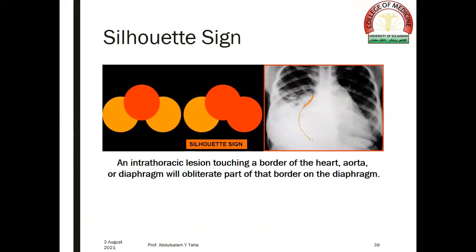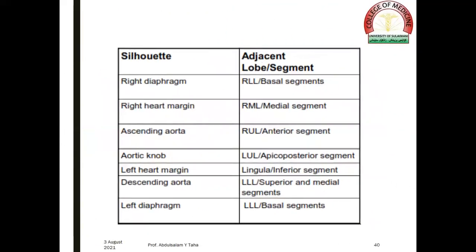The silhouette sign is an important radiographic sign. When an intrathoracic lesion touches a border of the heart or the diaphragm, it will obliterate part of that border. In this chest radiograph, the right cardiac border is invisible because of a nearby homogeneous opacity in the right lower zone — therefore the silhouette sign is positive and the diagnosis is most probably pneumonia of the right lower lobe. The table shows positive silhouette signs in different regions according to the location of the abnormality.